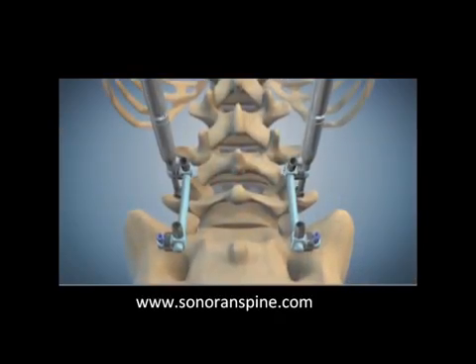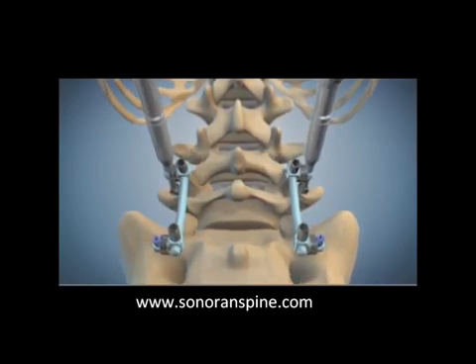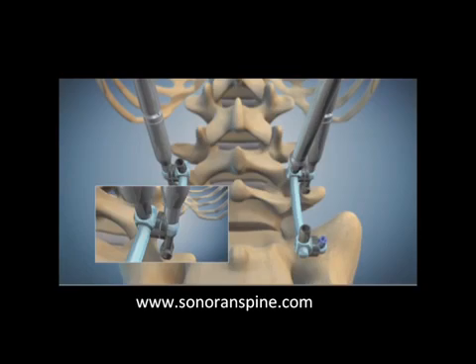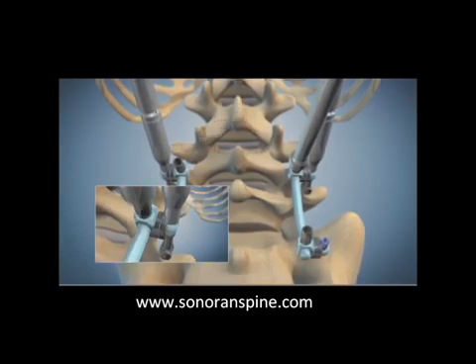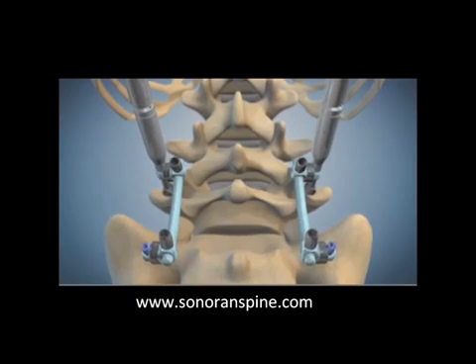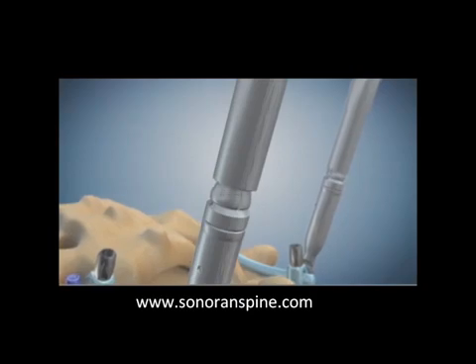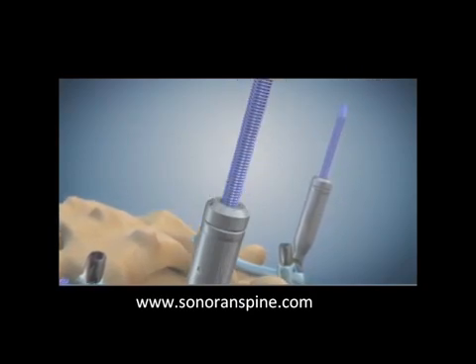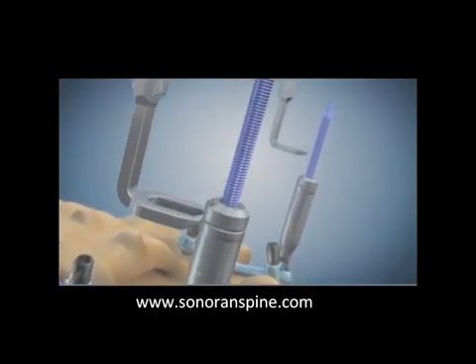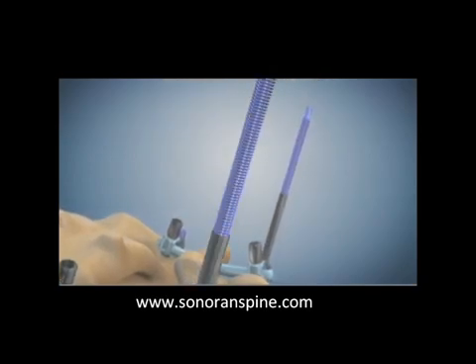With S1 being stably and solidly held in position, that is the base to which L5 is pulled back. Once the correction has been achieved, compression can be placed across the posterior column, and those top set screws are then locked into place. That locks the construct together. The quick-threaded driver is removed, and the unidirectional rod crimps come off quite easily from the post.